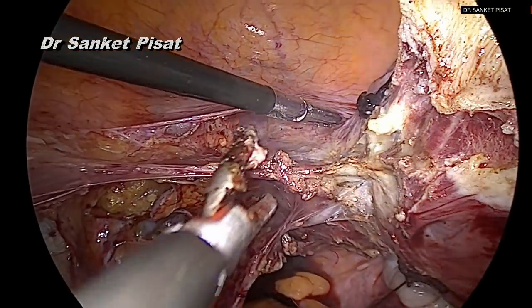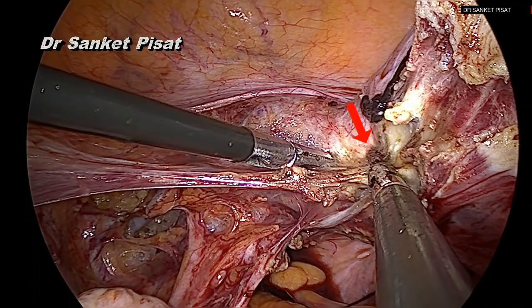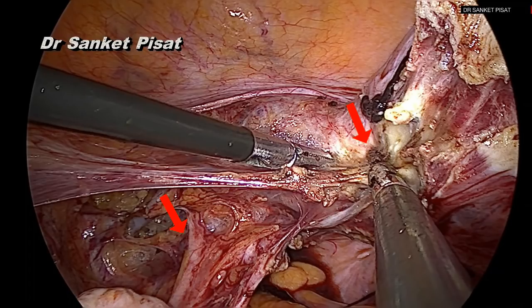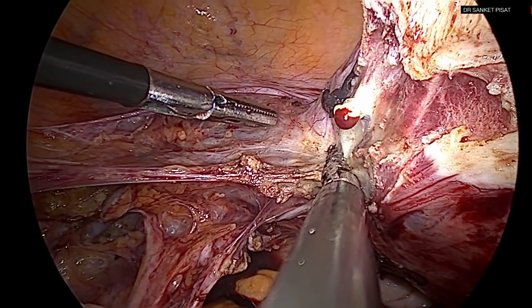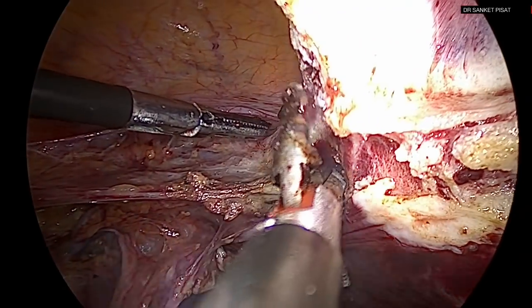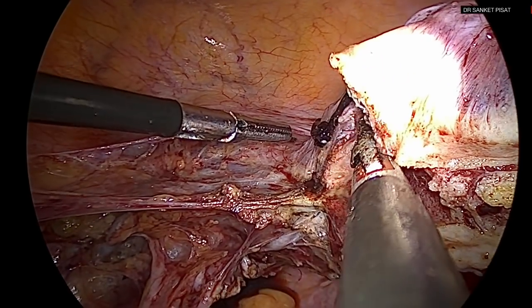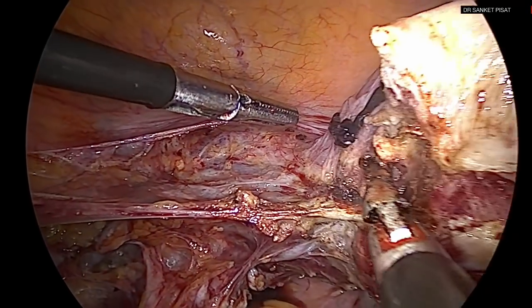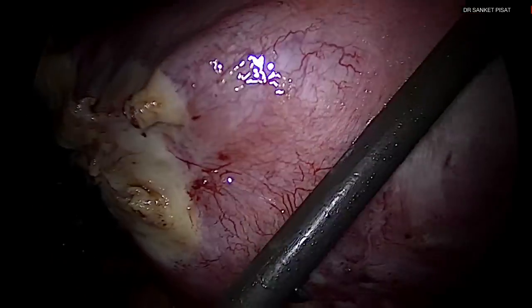This second part of the video illustrates the distance between the uterine artery when bipolar coagulation is applied and the ureter in the lateral pelvic wall. You can see that if adequate traction is given from the vaginal end, there is a distance of at least four to five centimeters between the two, and so bipolar current can be safely used. This does not require prior lateral pelvic wall dissection, and is an illustrative example that if adequate traction is given from the vaginal end or by using a myoma screw, the ureter will never be in harm's way as long as adequate precautions are taken and excessive use of energy is avoided.